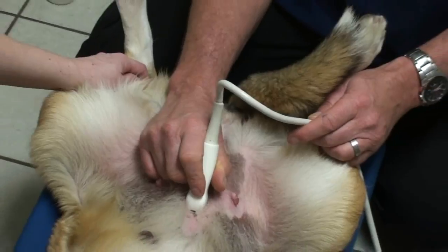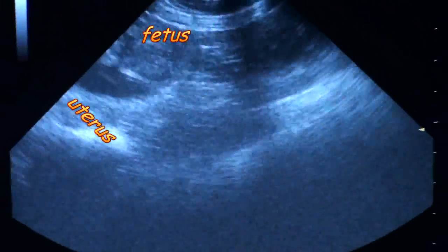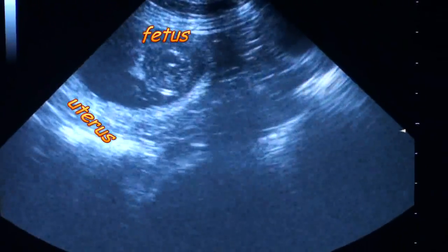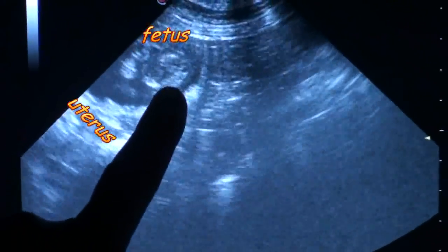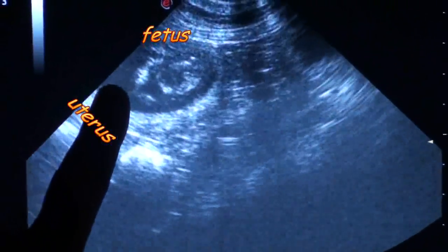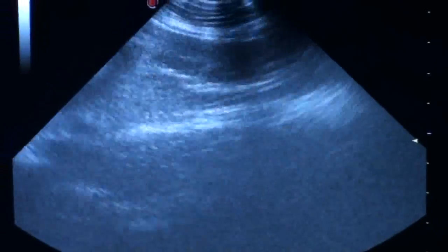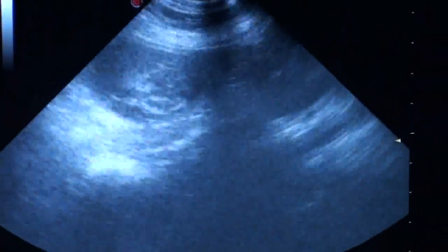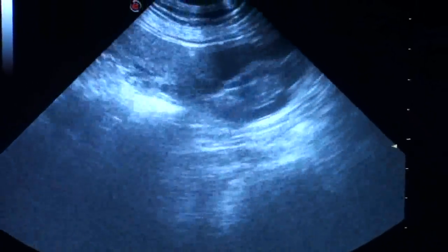When you do an ultrasound, you see kind of vague images, but you can definitely see the lining of the uterus. You can see the fetus — kind of a glob in the middle — and the dark areas are all water, which is the amniotic fluid surrounding the baby. I just move the probe backwards and forwards to get an idea if there's more than one fetus.